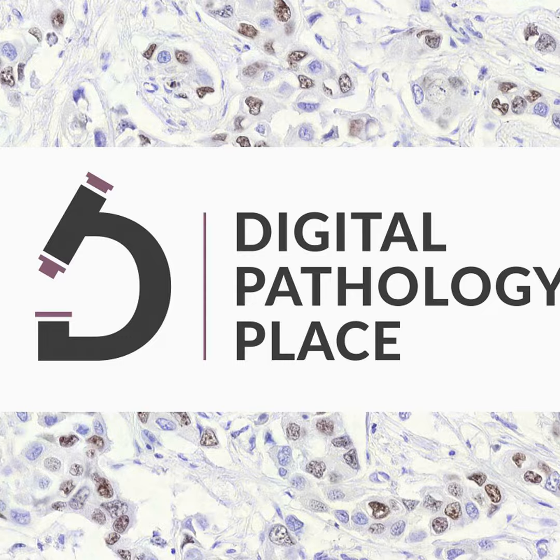And I think the things you mentioned, the system usability, the critical task, the risk analysis around that, is that adequate for primary diagnosis? We can test that today. And then image quality, right? There are actually metrics within the FDA about what constitutes image equivalence for pixel identical images, and that could certainly be expanded to include pixel non-identical images or images of a particular type. There are metrics to do that. So I think we're entering an era that maybe relieves some of the burden around the creation and definition and updating of these systems in the future.